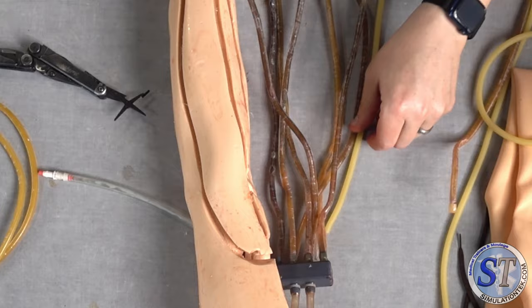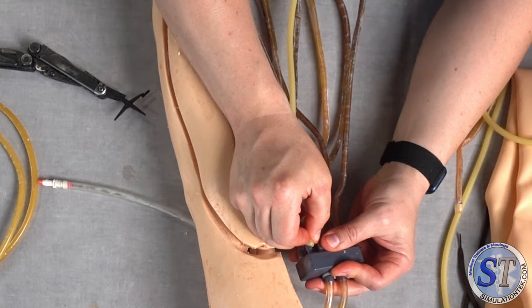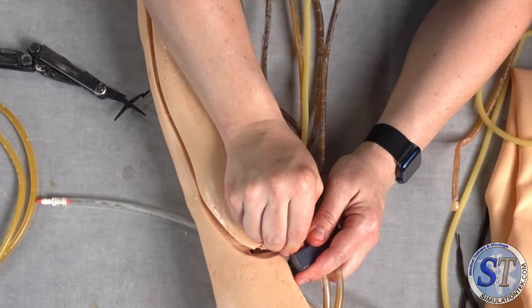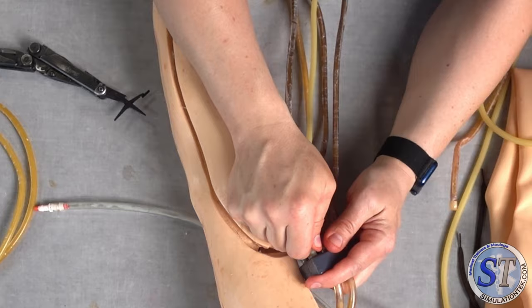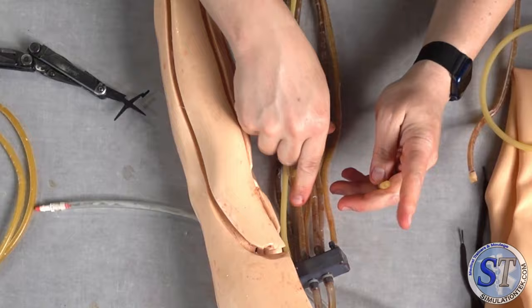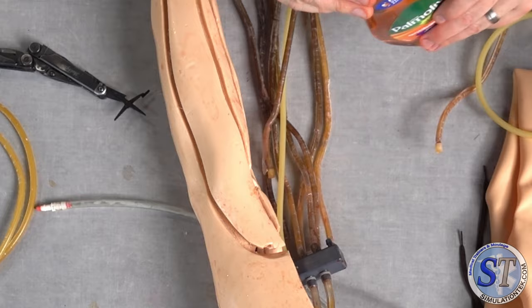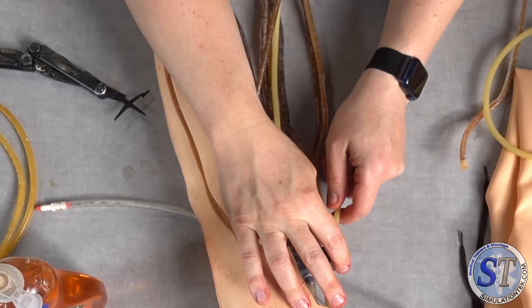I'm going to stick it on the manifold here. A lot of times I'll use just a little bit of lubricant. The soap works great because it'll dehydrate out and it won't be a problem. You want to get that on there as much as possible because you don't want it falling out later when it's in the arm and somebody pulls it. I'm going to connect it. That's the first one done.